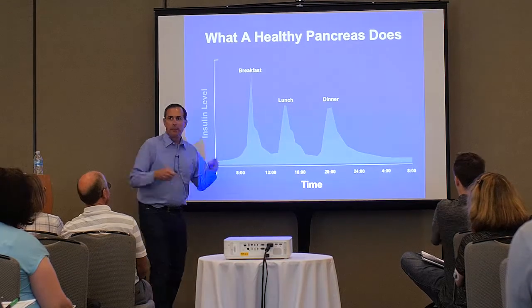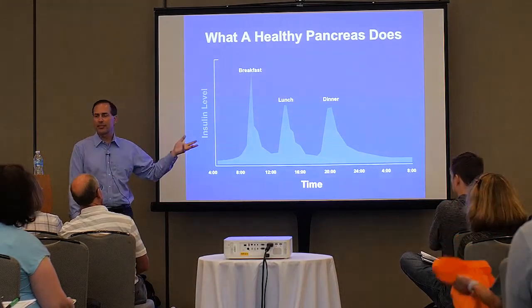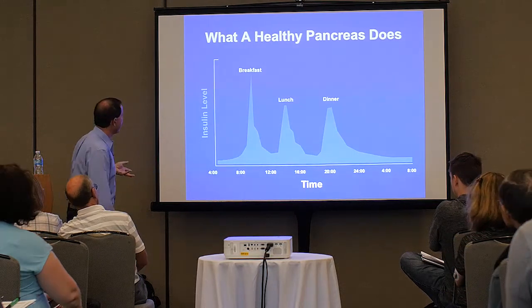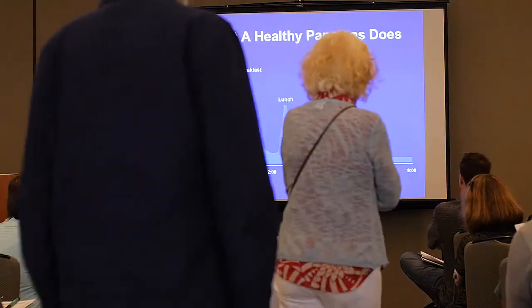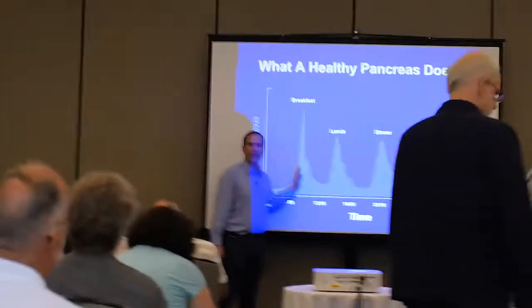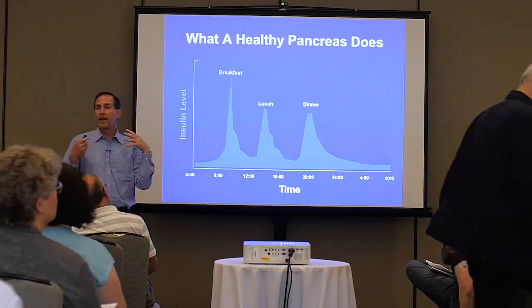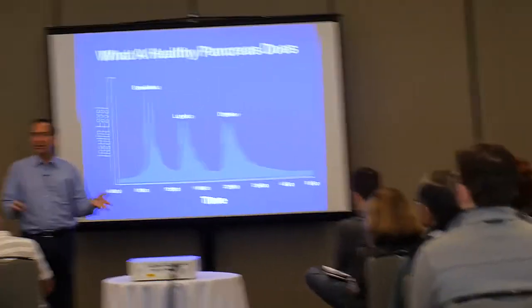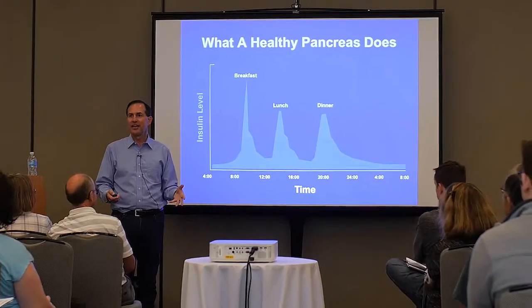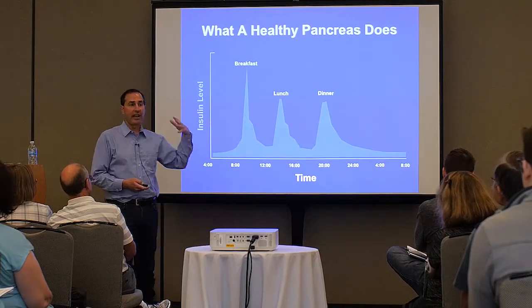So, by way of background, before you develop type 1 diabetes, this is what your pancreas did. It always produced a little bit of insulin, including overnight, and as soon as you started eating, your pancreas, your islet cells, would start to release insulin. So that's what a healthy pancreas does, and that's what, being on a pump, you're trying to replicate. Now, we're not there yet. You heard about the exciting ways we'll get there, but we're getting closer.